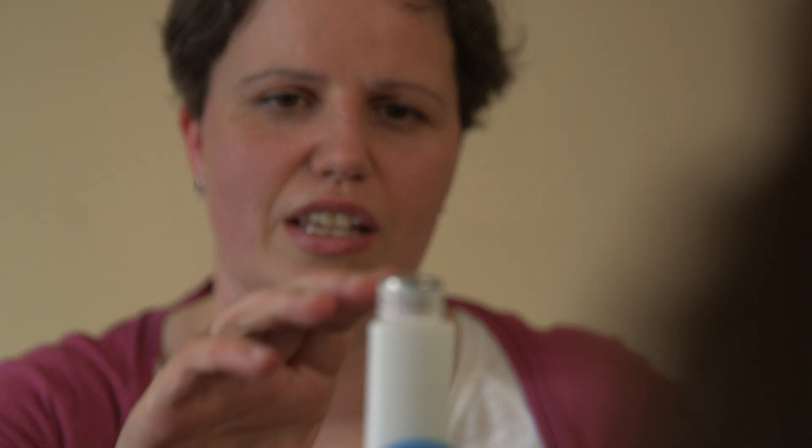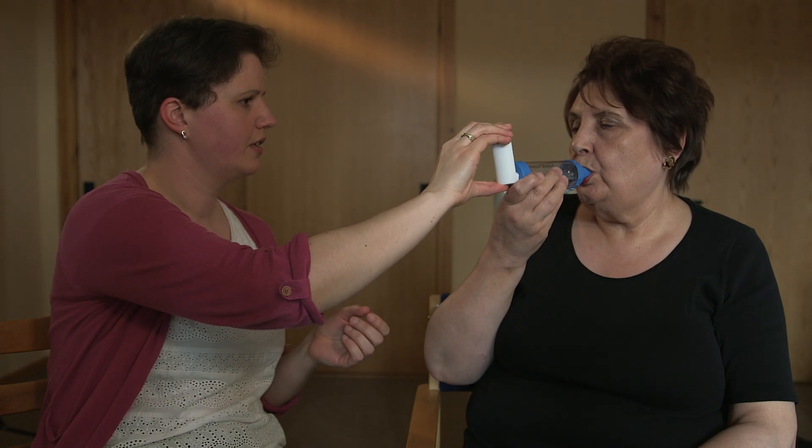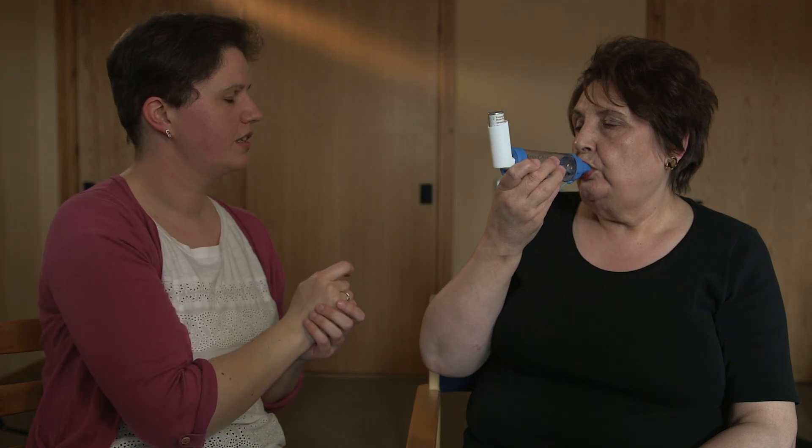So we'll do the same again. Breathe out, put the spacer into your mouth, start to take the in-breath. Nice deep breath in. Hold your breath for as long as you can and then just breathe out. That's you done. Thank you.